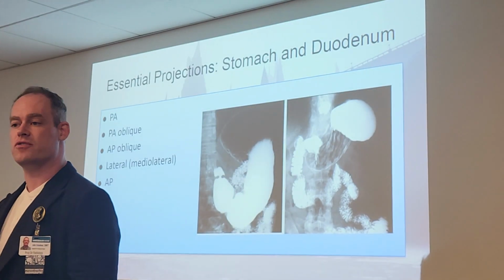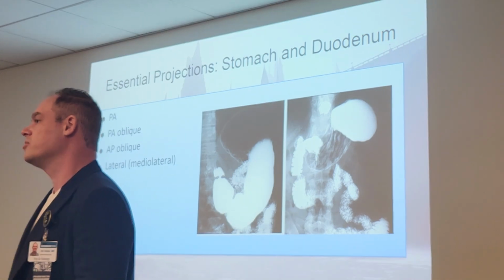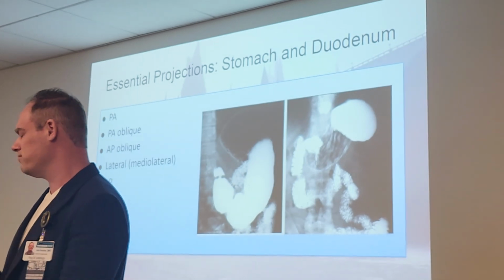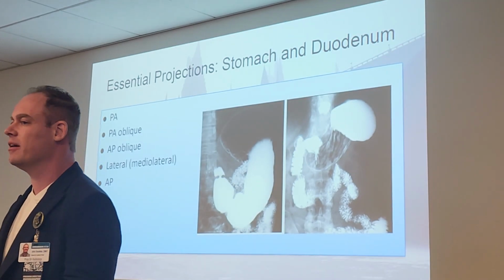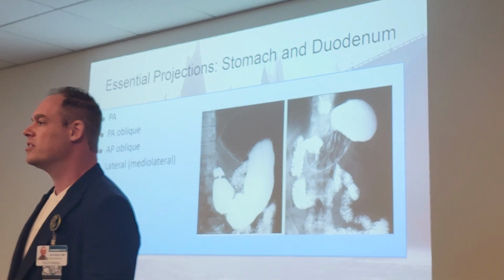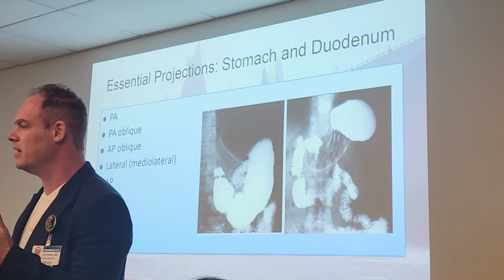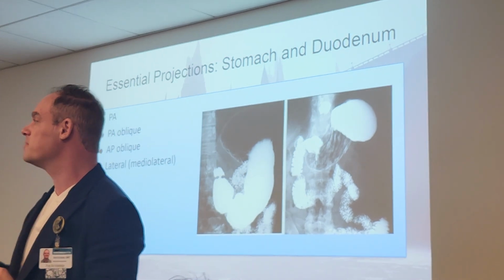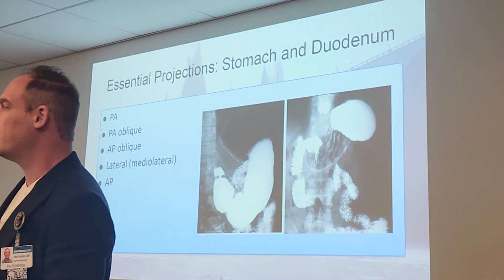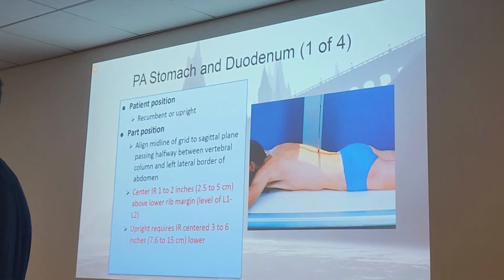All right, here are our positions for the upper GI, a little bit more to remember here. And these are notoriously difficult to remember, guys. Once again, I would try to make myself a little chart because it's one of these areas people just miss all the time. I remember having trouble with it when I was in school as well. We're going to take it one slide at a time. The main points I want you to remember for each of these positions are in red. We're going to look at the PA, PA oblique, AP oblique, the lateral, and then AP, the stomach and duodenum projection.